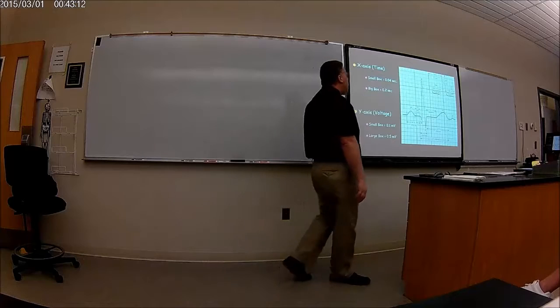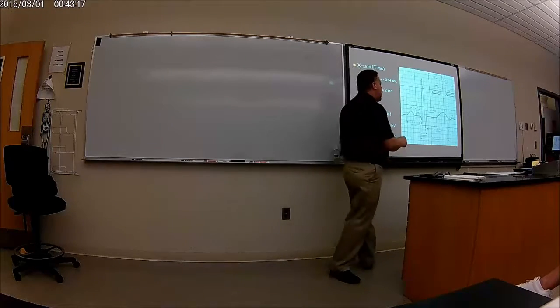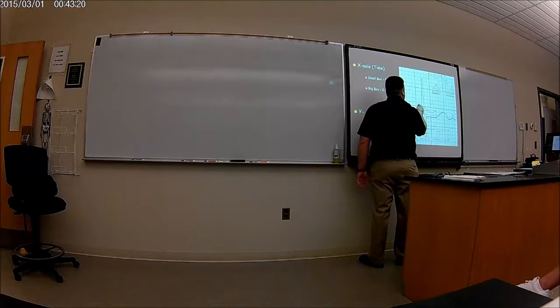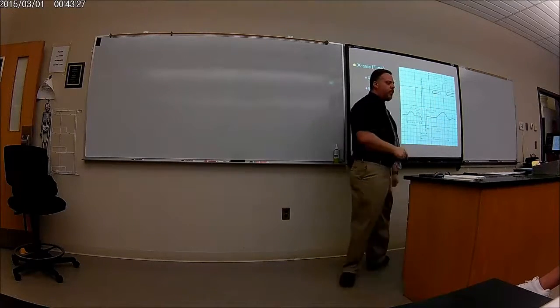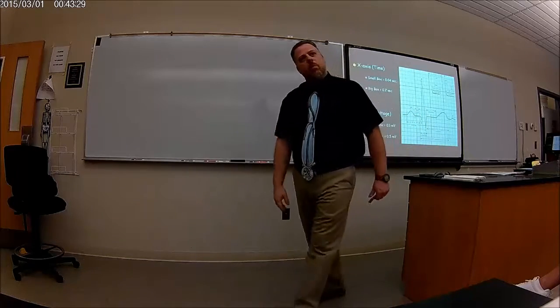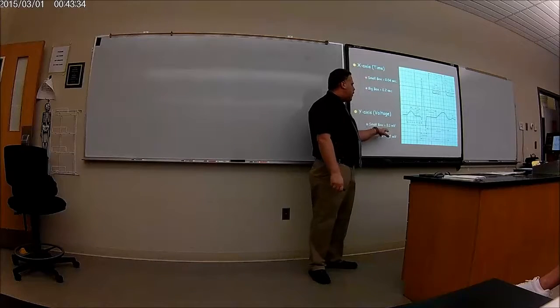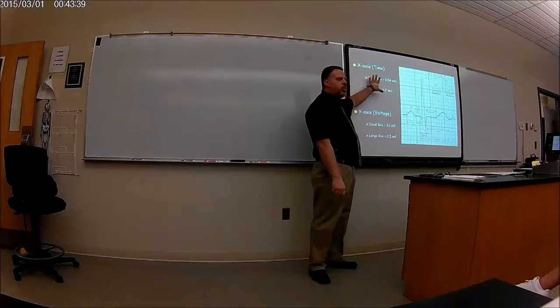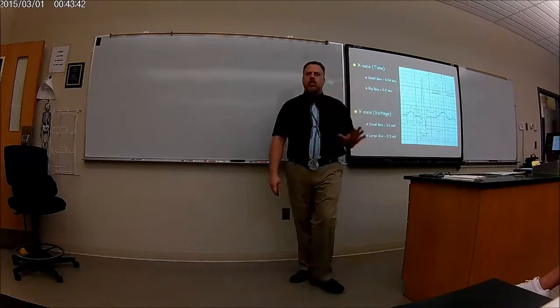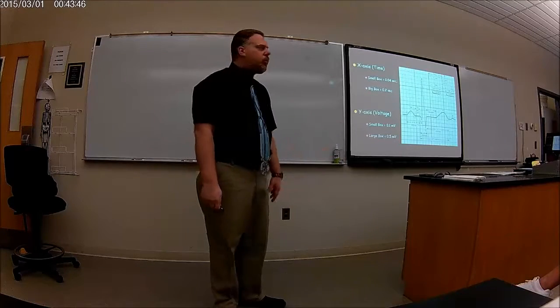I won't ask you about what each second is in small boxes and big boxes, but can you see the small boxes? That's the small box. There's a big box. Do you see the darker bolded line? There's another big box there. You're going to have to count these. I won't ask you what each one is, but just understand volts, millivolts are on the y-axis, and seconds are going to be on the x-axis. But don't worry, at least for this class, you don't have to worry about 0.1 millivolt and stuff.